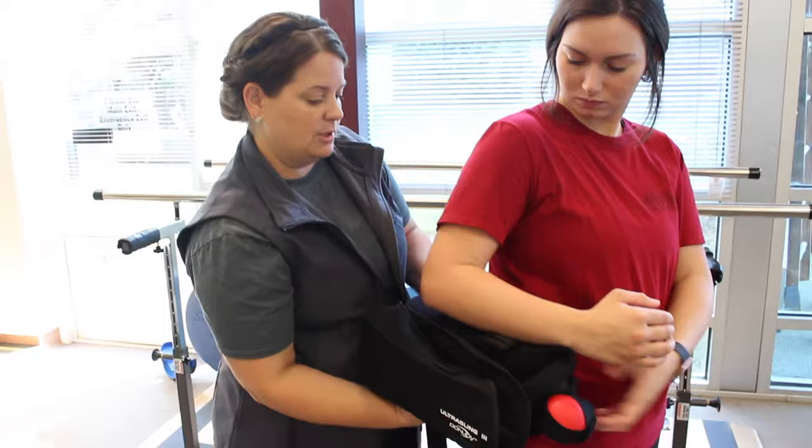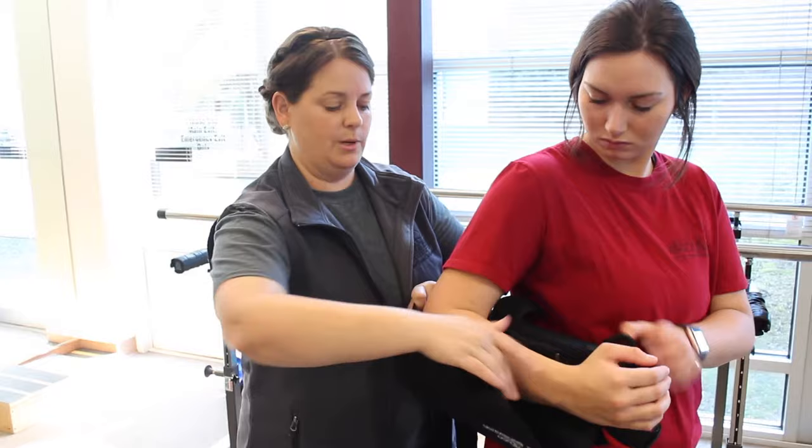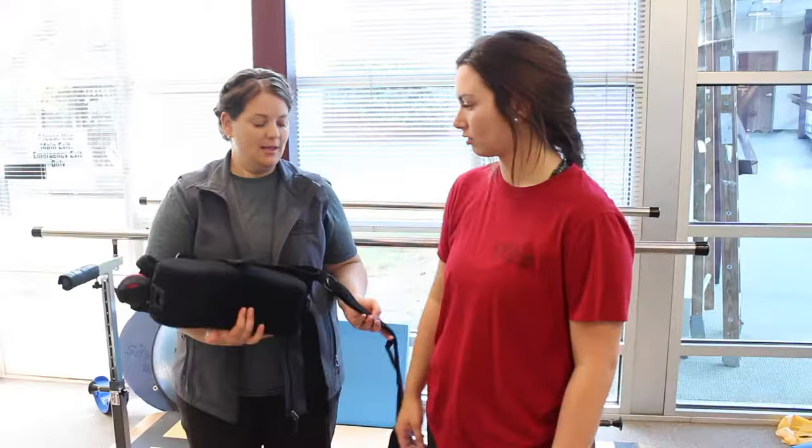It's very helpful if you have someone assist you with putting your sling on, especially a few days following surgery. So feel free to share this video with the person who's going to be helping you out after your surgery.